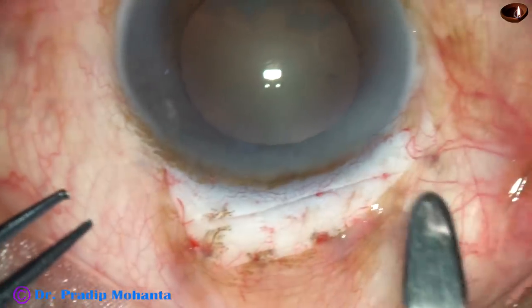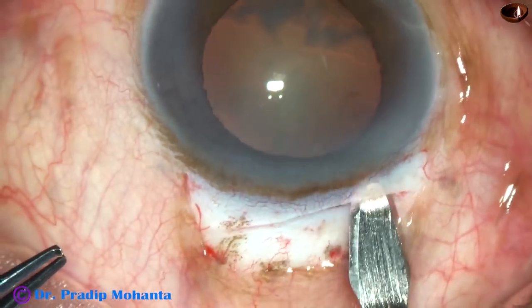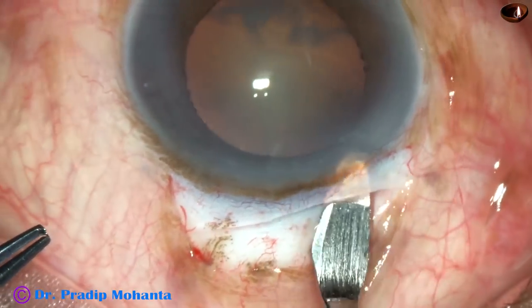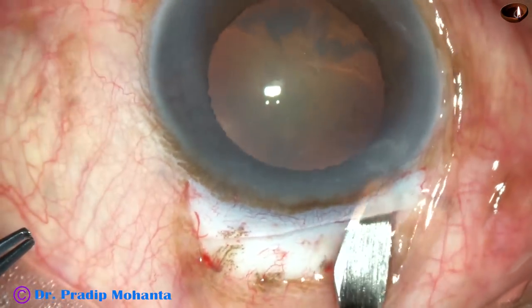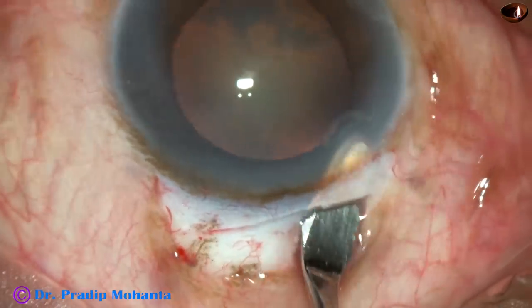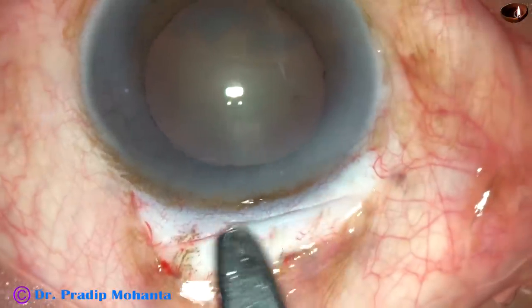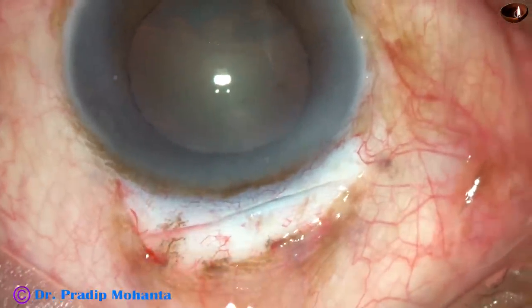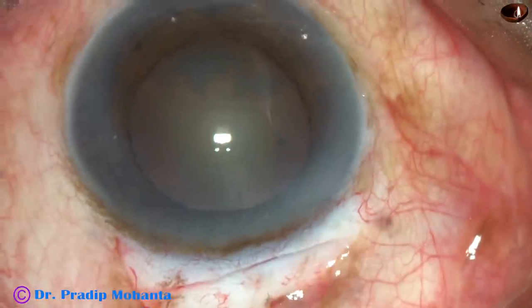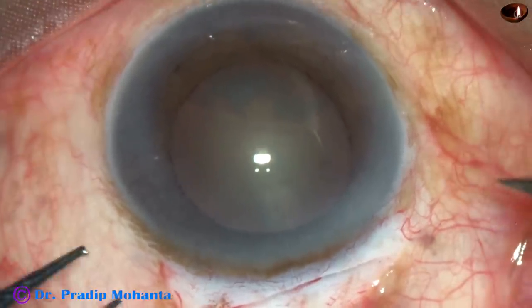Now we have to go to the right side — again, the same way. Go forward and sweep backward and sideways. The inner opening of the tunnel should be a little larger, so you go laterally more and make it a funnel kind of opening. The tunnel is prepared.